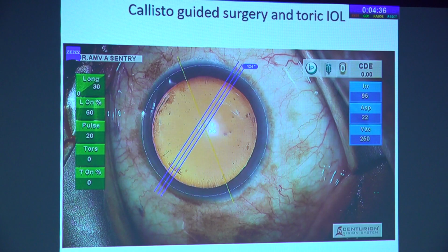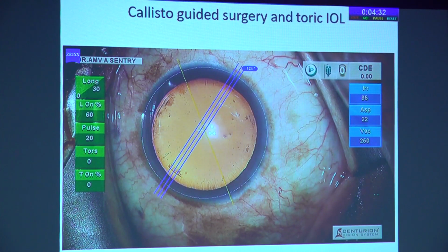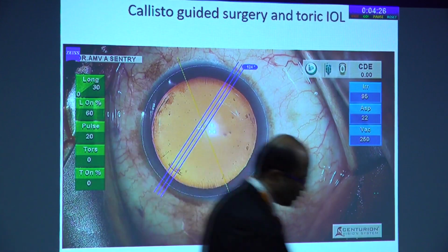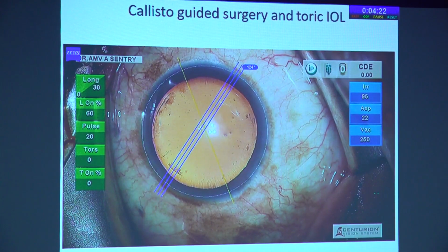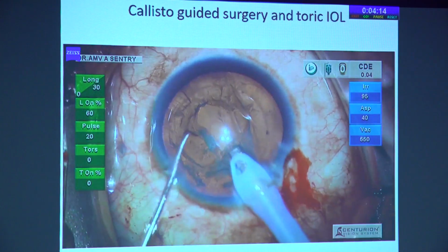As you can see, before the surgery is beginning, the Callisto machine is turned on. The yellow line will represent the 180 degrees, which has already been captured by the IOL Master 700. The three blue lines are there, which is where you need to align a toric IOL. You need to align along the central blue line, which is now the 124 degree mark here. As you see here now, the surgery is about to begin. So we'll just fast forward through the steps.